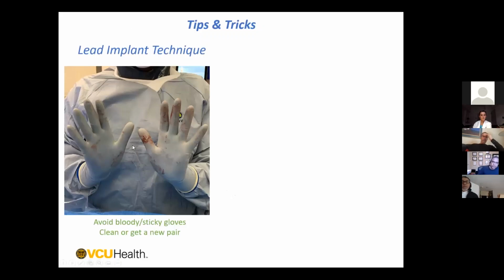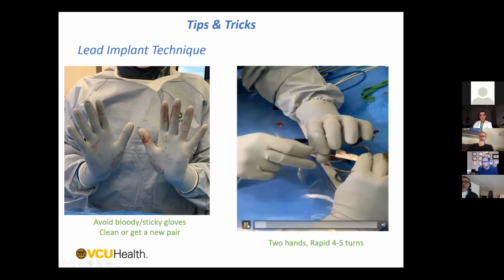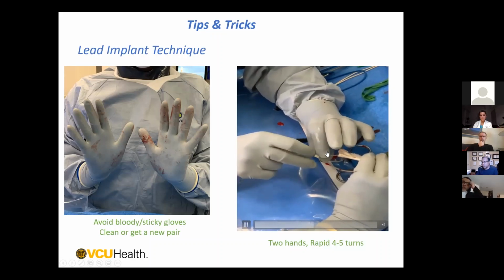So this is the rotation technique, and he's purposely showing his gloves. I know this sounds like a bit of a minor point, but I always wash my hands and dry them off before I do the rotation, because it really does help in terms of getting a good grip on the lead and rotating the lead. And you'll see that it is a two-handed technique, and you're turning the lead with both hands simultaneously, one close to the hub of the sheath and the other one a little further back. You want to use that two-handed technique for rotating the lead.